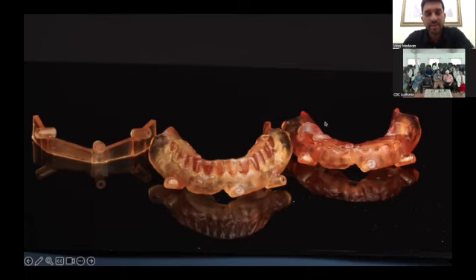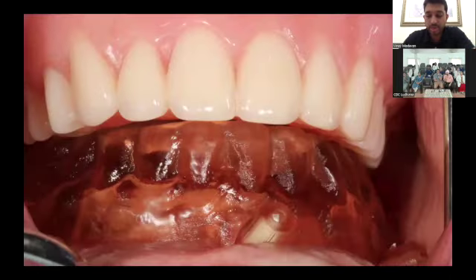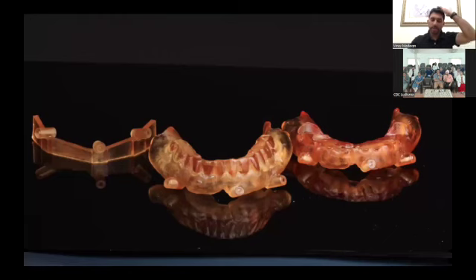So what I'm saying is, from start to finish, when the patient comes in, you not only discussed treatment options with the patient, but you also evaluated it. You've diagnosed the conditions, you've given her some options, and you have planned the implant placement, and you go ahead going into the surgery. Now, when we go ahead and do the surgery, this is the first guide that fits in.